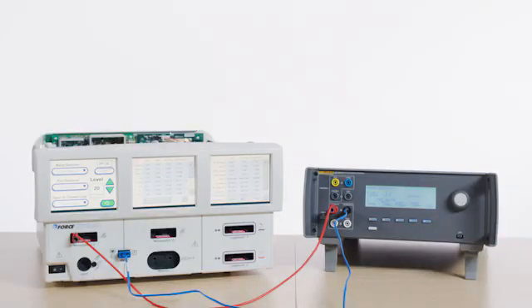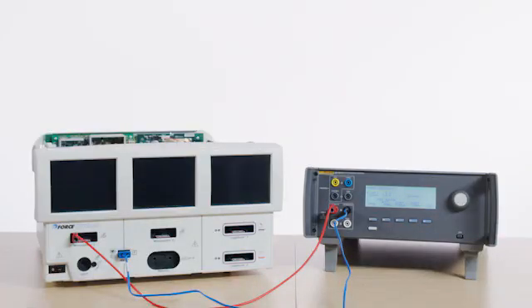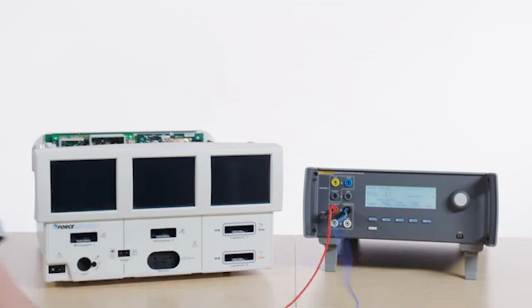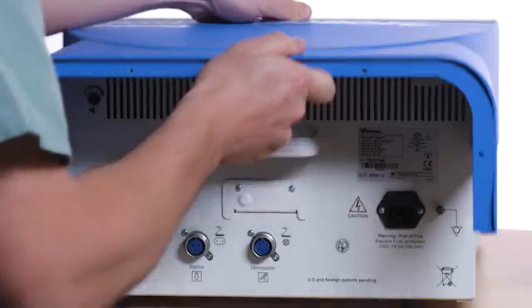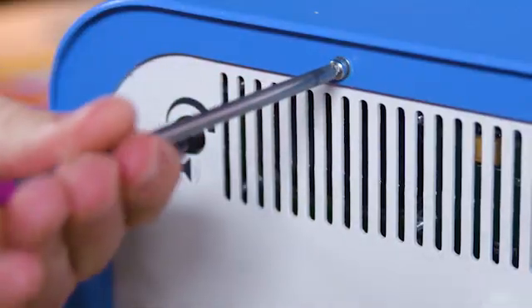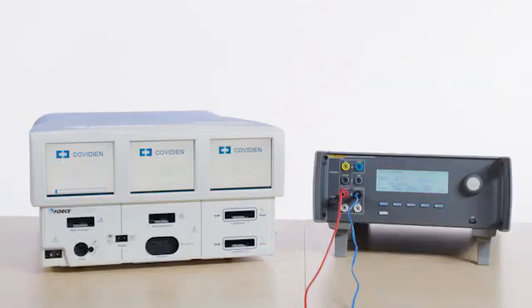Select Stop RF when the optimal current value has been reached. Turn System Off. Unplug the leads. Apply Loctite or an equivalent to the Inductor Potentiometer. Re-install the cover on the Force Triad.